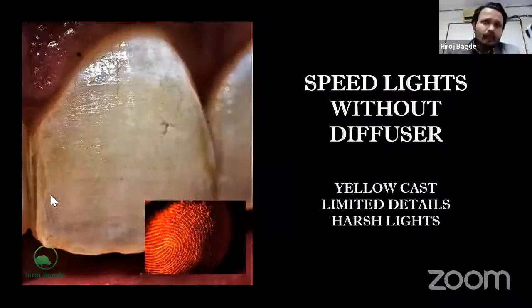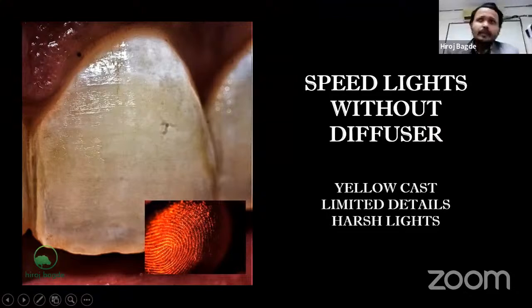So speed light without diffuser is not advisable. Now, this is the twin light system, which I was talking about, twin flashes on both the sides. Now see, can you see the line angles? But some details are lost due to this flash coming inside the line angle. So details are lost. So what to do? Twin lights, again, don't have much details.